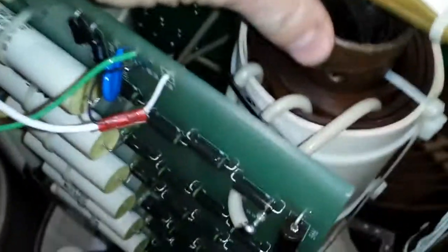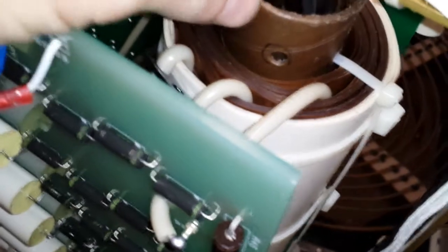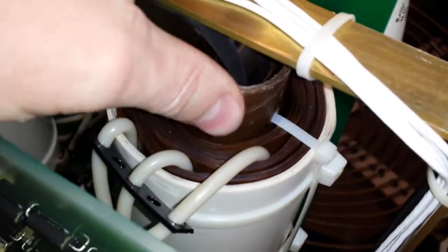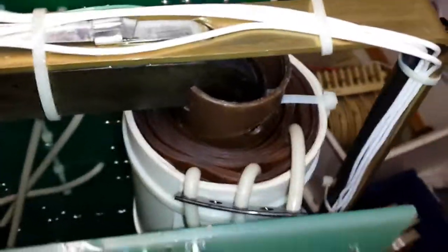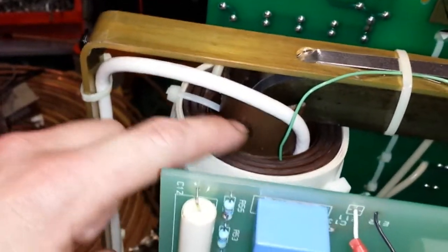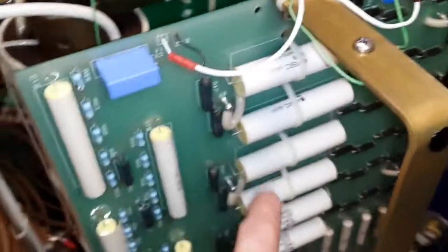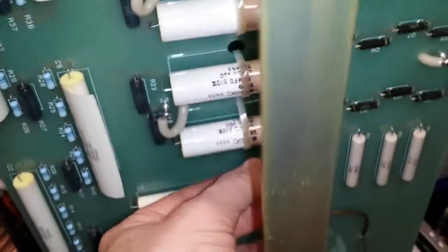And it's on some sort of, it looks like some loo roll or kitchen roll. That's what it looks like. But because of the oil being in there, it makes the fibres a lot stronger. It's like rope, you know, when it's wet, it's stronger. But yeah, it does look like loo roll. Somebody's drawn pen around one of the holes there, and it's the same all the way around. But yeah, each one of these is 15 kV at how many microfarads was that? I can't see. That's in microfarads.